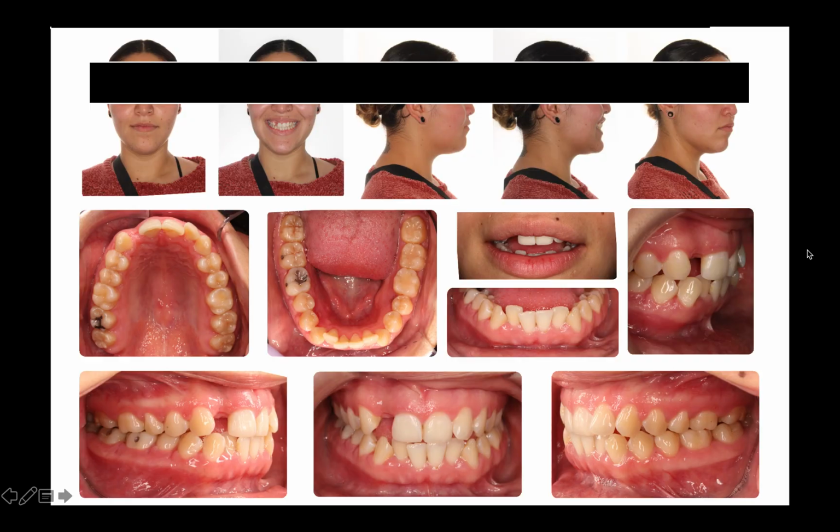So here are the pictures taken by Dr. Mana Naeem in the Graduate Ortho Clinic. You can see at the consultation where they talked about everything we talked about. And this is a really good picture showing that we really want this line to be pretty straight. You can see that she's pretty far out anteriorly, if you will, here on the face. And so we know we had room to come posteriorly to give her a more natural and straight smile line.